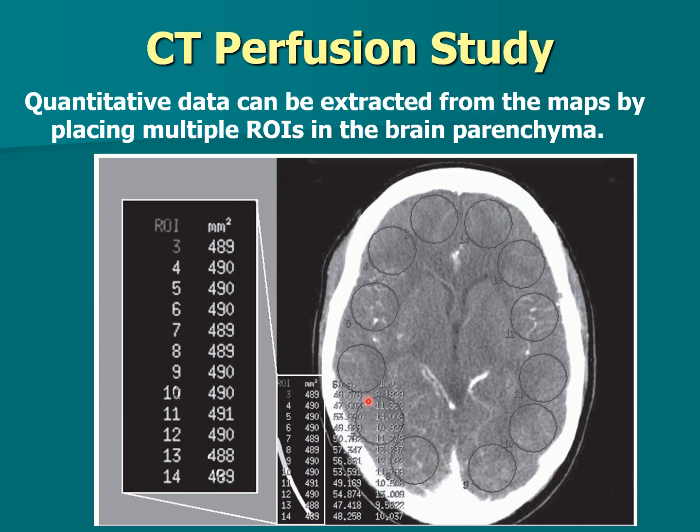So you give the patient contrast and then you do this particular type of study. Again, let me say there's numerous ways of doing this, but the whole objective is to compare different areas of the brain to see if it's getting the same amount of blood flow. I'm going to measure that blood flow by giving contrast, because then I can measure the amount of the contrast. So if we look at this one, this is pretty even because it's looking at ROIs.